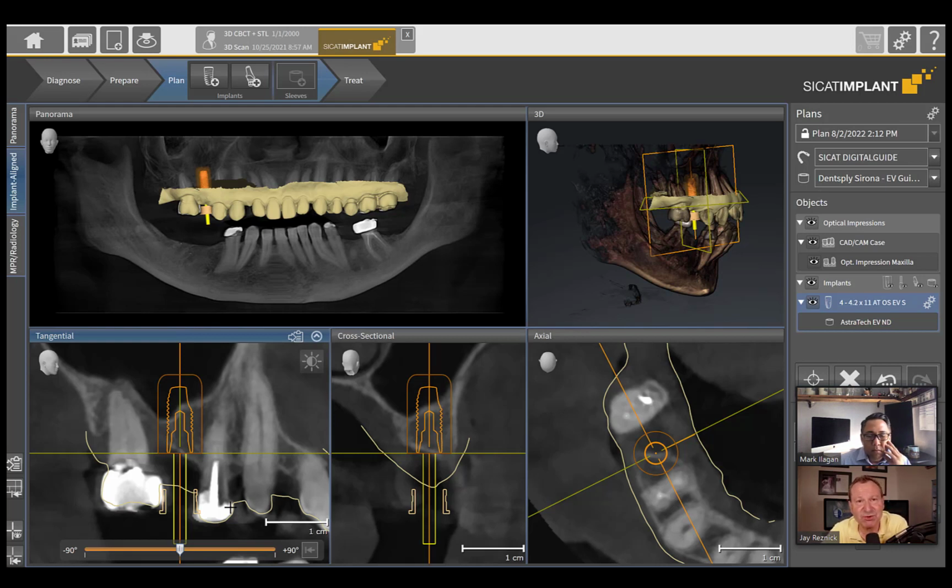So this allows the patient to really visualize what's going through my head so that they can understand what the treatment plan is and why we're going to do things the way we're going to do them. This is a really great teaching tool to educate our patients about our treatment plan and to get them to understand why. And I found when you have a patient who's educated, they just do a lot better. They have an easier recovery, they have better long-term success.